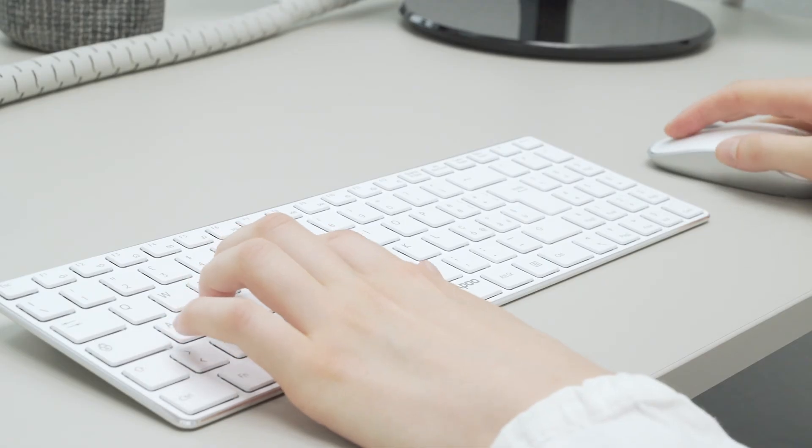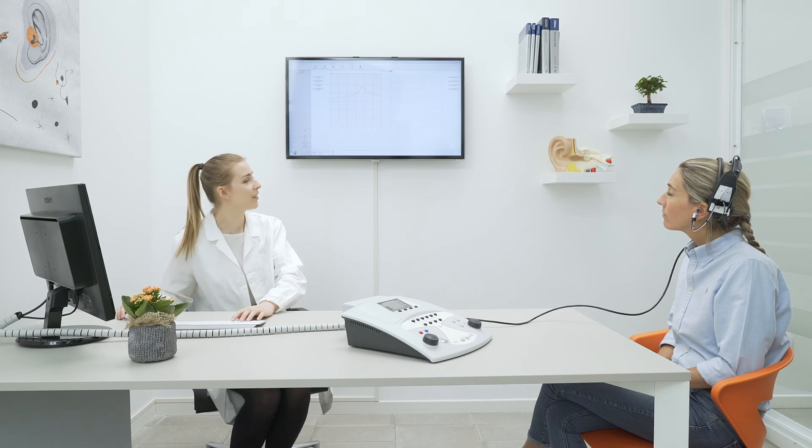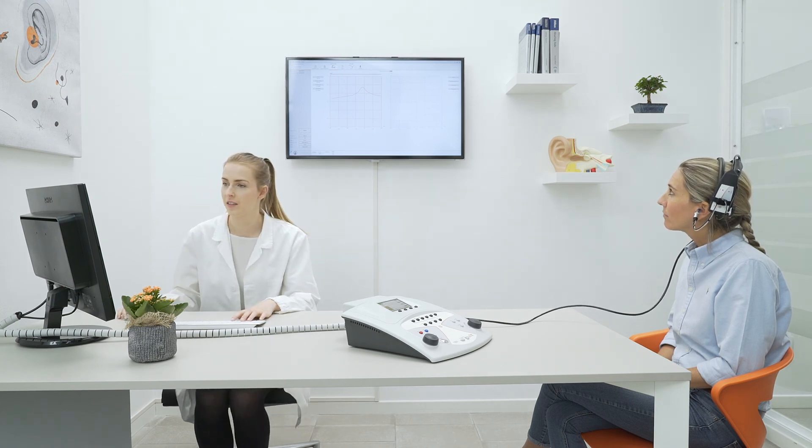With the live view feature, you can have a wide view of the examination in progress on the computer display.